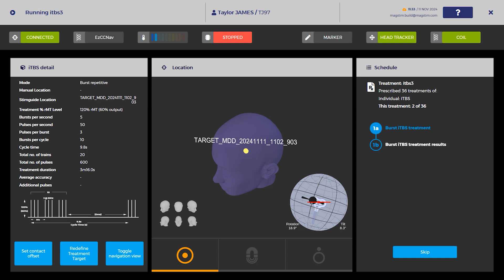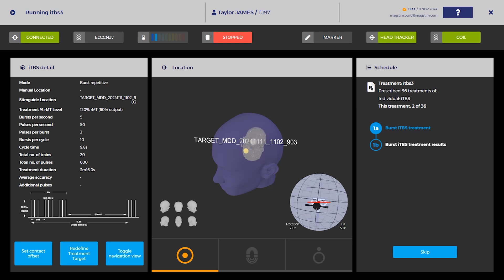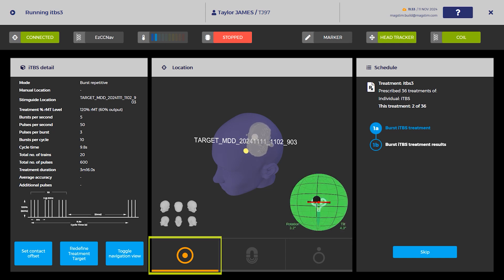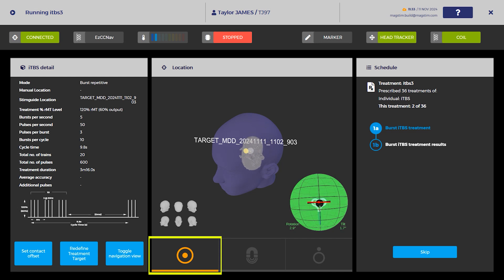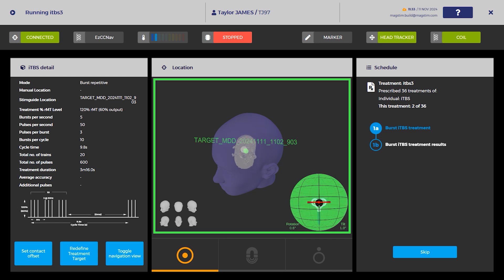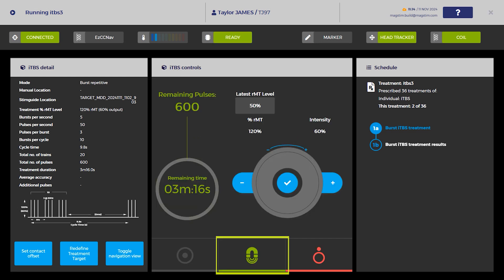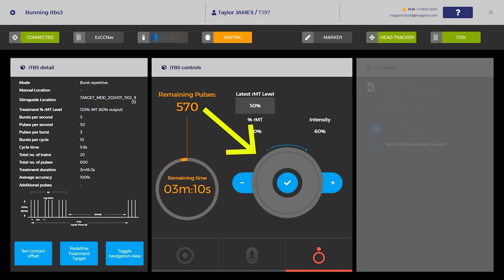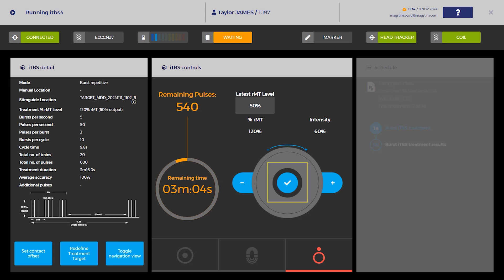On the treatment screen, confirm the required treatment is displayed in the treatment summary. Press the amber arm button to charge the system. Confirm the coil placement and press the green trigger button to begin the treatment. The power level can be adjusted before or during treatment using the scroll wheel. Select the check icon in the center of the rotary wheel to confirm the power level change.